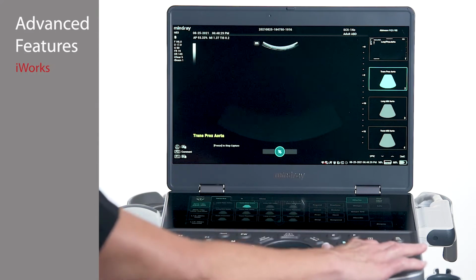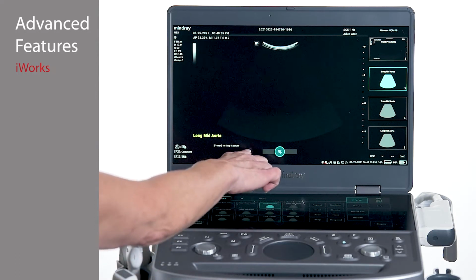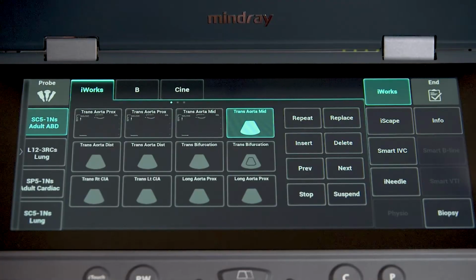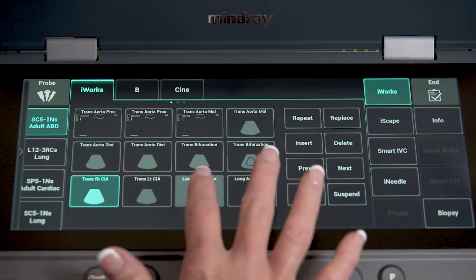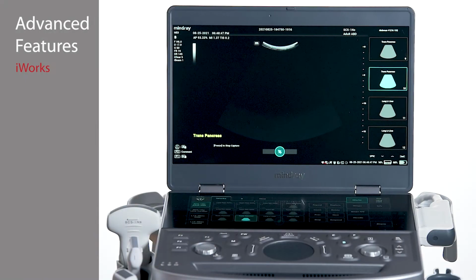For views that activate different modes, require measurements, or activate dual, follow the prompts along the bottom of the imaging screen. The system will automatically advance to the next view, or tap on other views using the touch panel to advance to different areas in the protocol. Proceed in this manner until the iWorks protocol is completed.